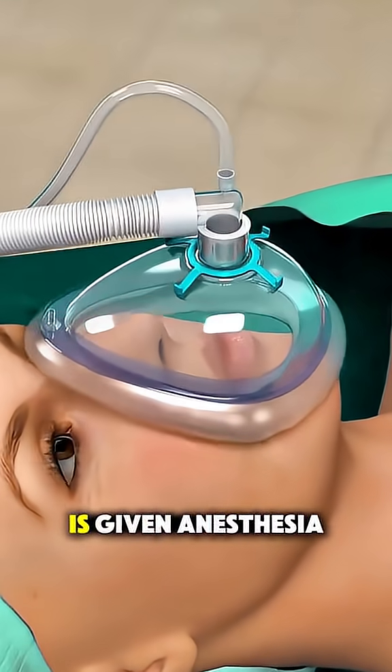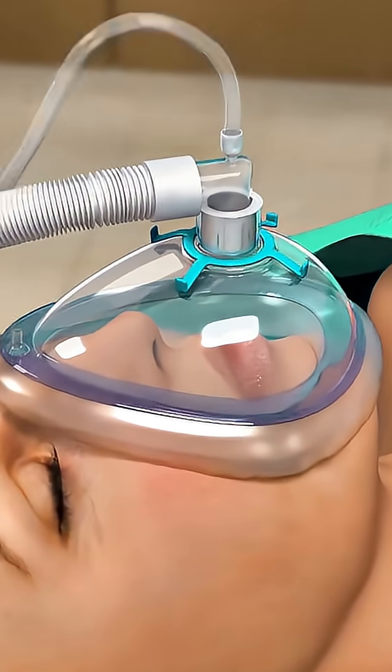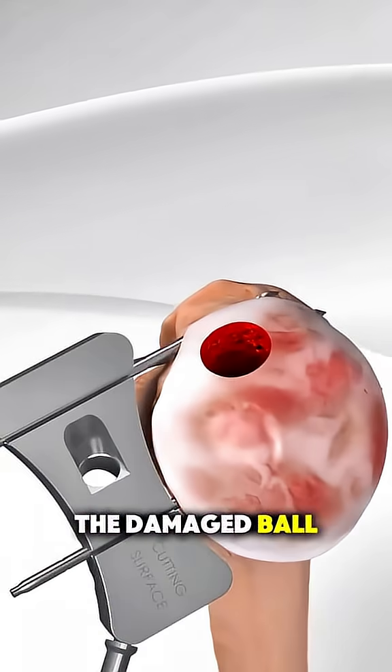First, the patient is given anesthesia to ensure they're fully comfortable. The surgeon makes a careful incision over the front of the shoulder to expose the joint.